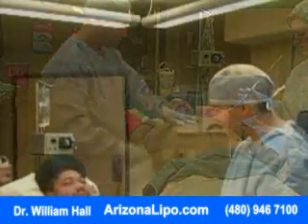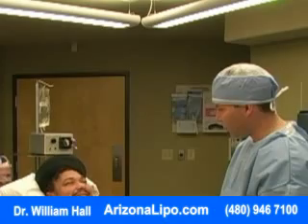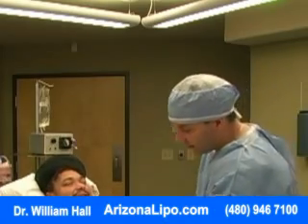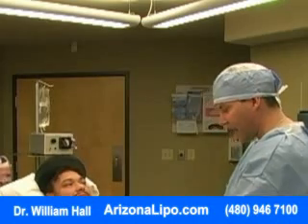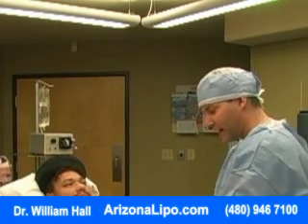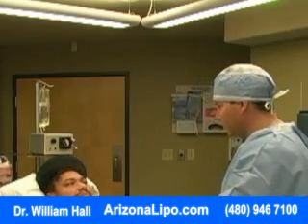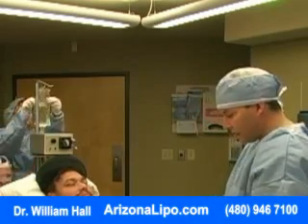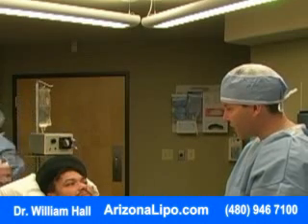How do you feel? Feel good. Good. Took a while to take that out, but you did really well. Well, thank you. And we just have the little incision sites. We got about 5 of them on the front, about 2 or 3 on each side. But a lot of this stuff you see in here right now is, of course there's a little bit of fat left there, but mostly fluid and inflammation. So you'll stay inflamed and swollen like that for the next few days, and then it's just going to slowly get better and better.